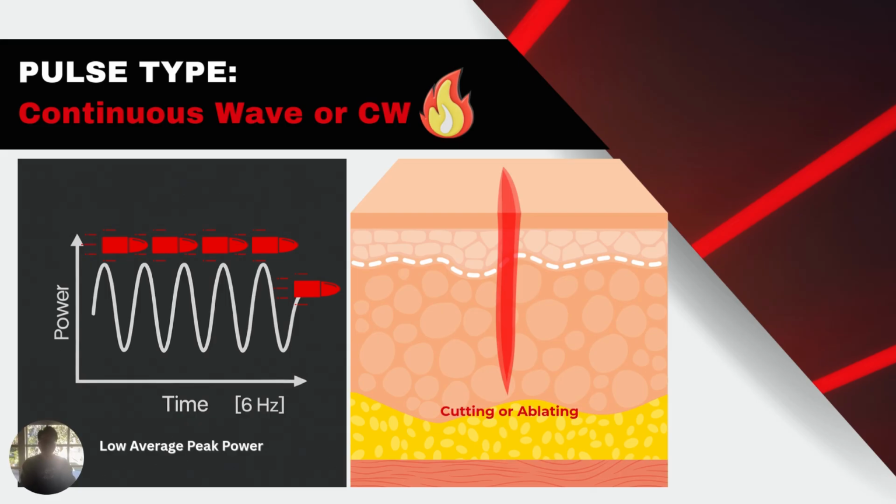In comparison to ammo shooting from a gun, we can compare this with a fully automatic rifle. You keep firing, but over time you run out of ammo. In this case, there is no endpoint until you release the foot switch or your trigger. As such, it works well with cutting your target, the tissue or the structure of the body.